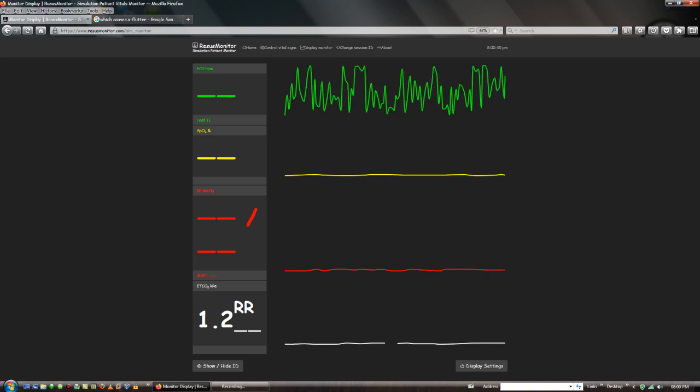This EKG rhythm results in a heart that is beating, but the heart's internal components are disorganized and quiver disorganizedly, and the heart is beating much faster.